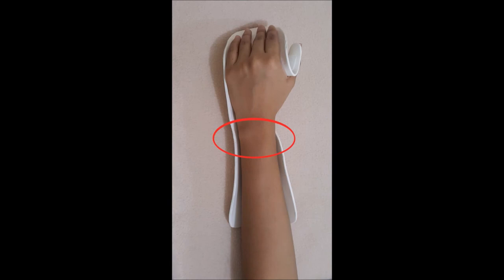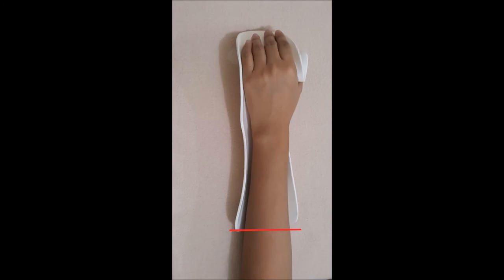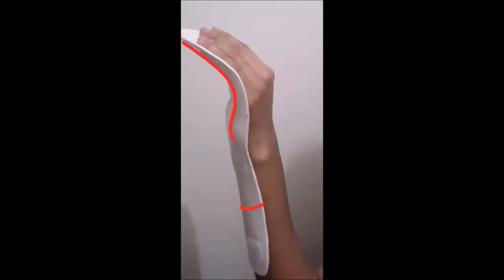Now check the following: The wrist should have adequate support. The finger pan is wide enough for all the fingers and has adequate length. The thumb trough has adequate length. Orthosis is two-thirds of the length of the forearm and half of the width of the forearm and hand. The arches of the hand are supported and maintained. Make sure that the orthosis does not cause any pressure areas.